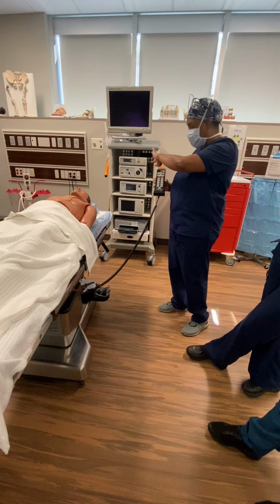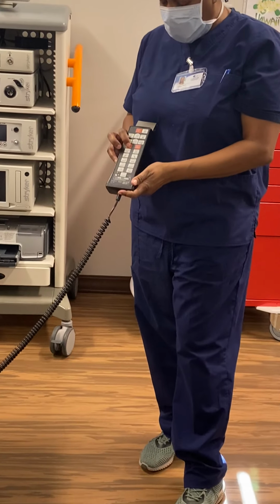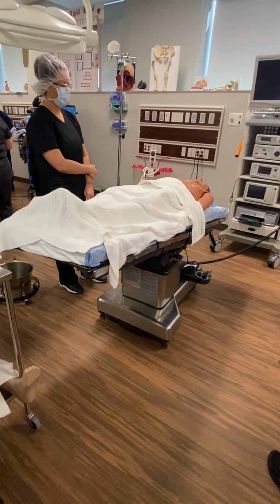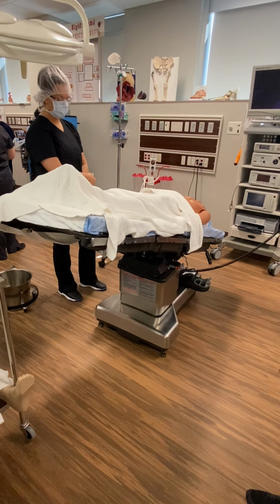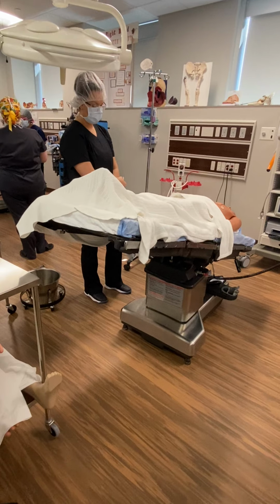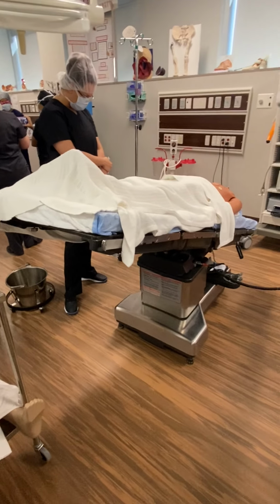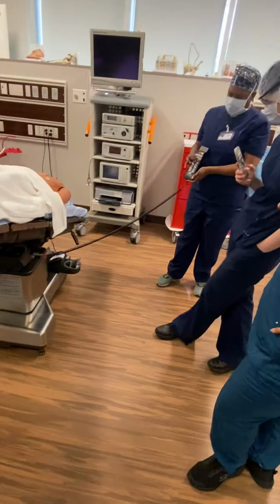If you want to move the bed, Trendelenburg, you hit Trendelenburg, okay? What can happen? The bed is locked, so if I move this, see, it's moving. We always want to make sure, because everybody is built differently. Cool. Oh, it's in perfect alignment, okay? And when you move the arm, you just grab the elbow and the wrist. Sometimes it pops.